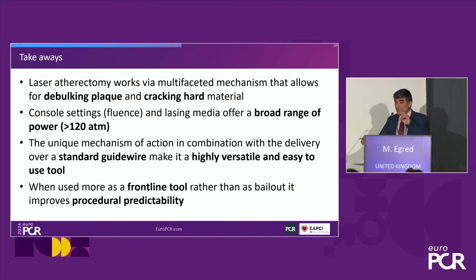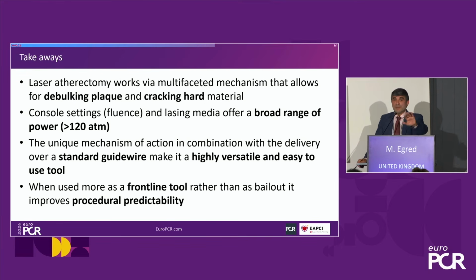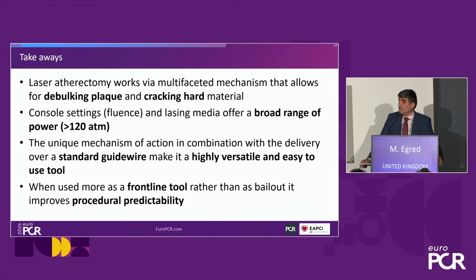Yes, thank you. That's a very important thing. I'm not advocating that. It takes a lot of experience to be able to use it without a wire. This is off-label. We're not here to discuss this. We're not here to tell you to do it. And the same thing with contrast. Technically, it's still off-label. However, it's been used all over the world, and it's very safe. Hopefully, in the next few weeks, our consensus document will be presented. And also, there'll be some clinical data collection to show the safety of laser. So we'll come to that another time, hopefully.